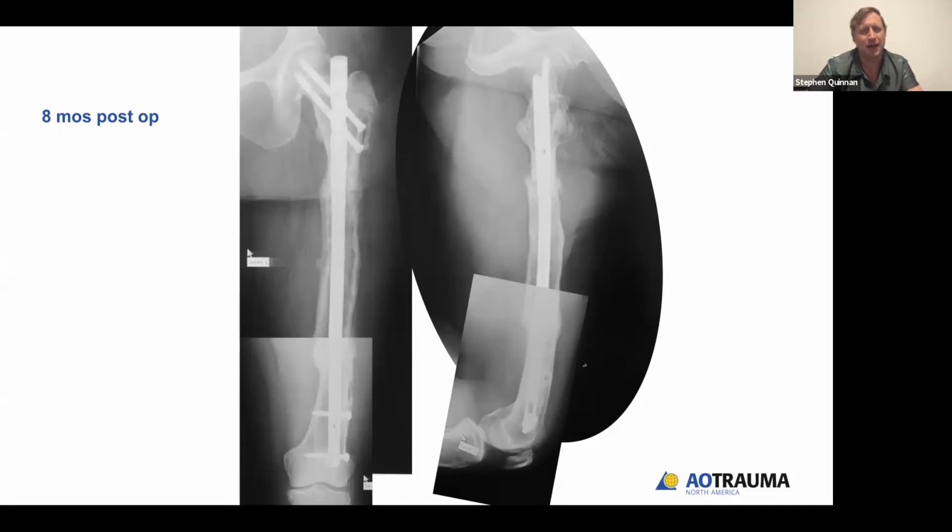It is in probably a little bit of varus, so we probably would want it a little more centered, but it does take a little more careful examination when we've got a very long span, not a malunion of a specific spot, but somebody that has a deformity over a longer area. You have to look at it a little carefully. Yeah.